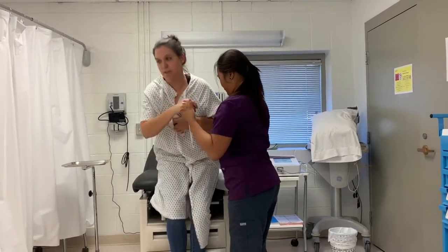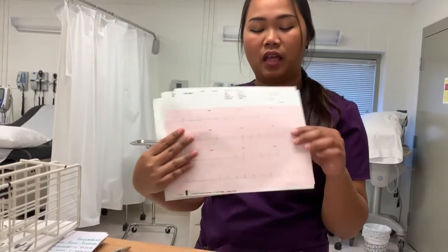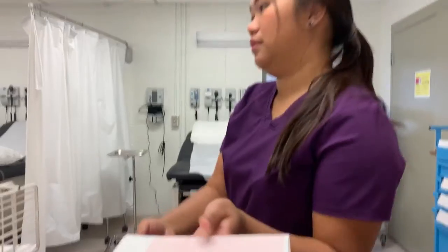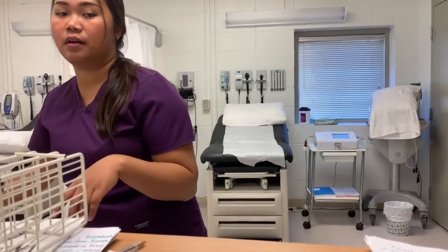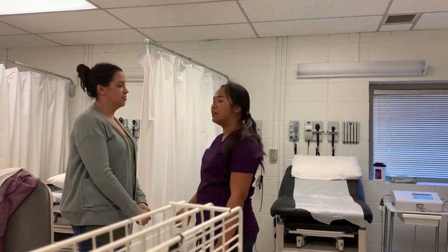Okay. Thank you. While I wait for my patient, I'm going to go ahead and check the ECG result. I'm going to ensure that the evaluation is accurate. I'm going to put the date, the time, and my initials on it. I have the date, the time, and my initials. I'm going to place this one in here for the physician to review, and the other one for the patient's order. Now that we're done, I'm going to go ahead and walk my patient.